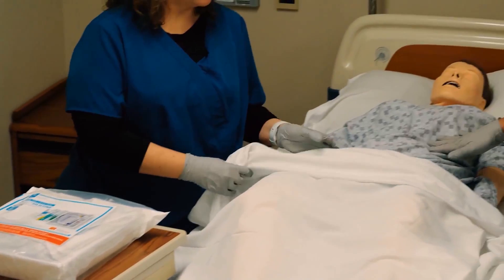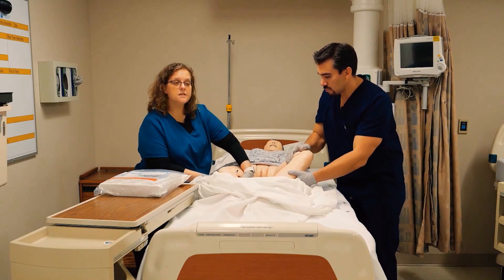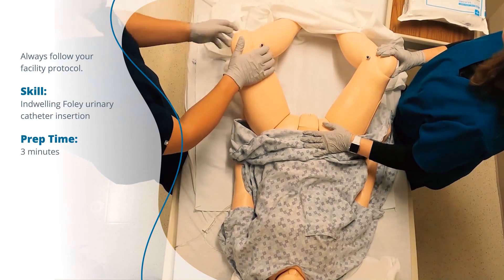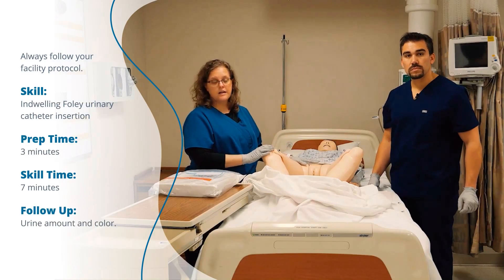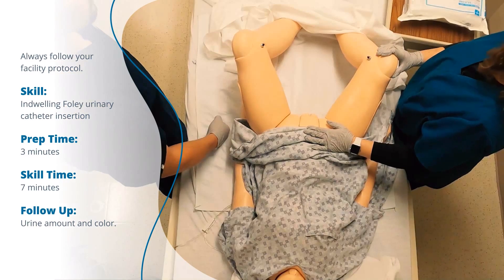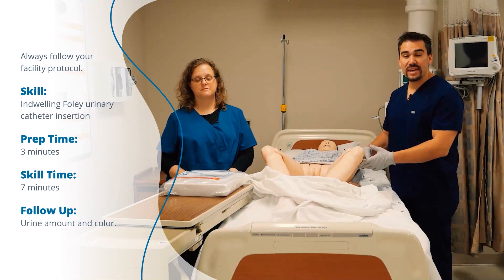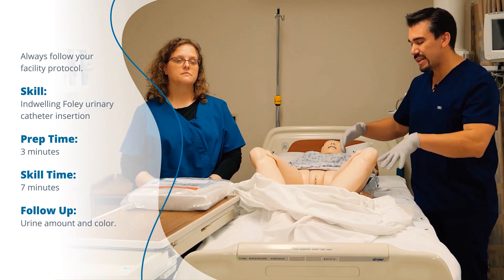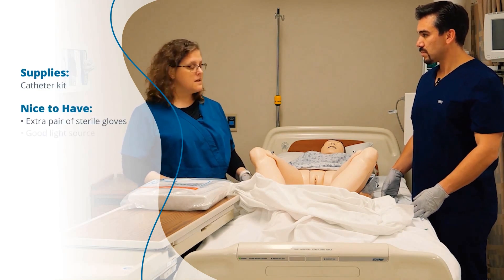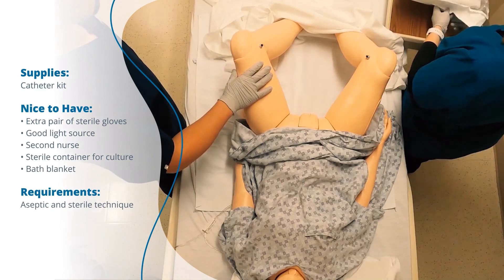Next, we're going to get our patient ready — tell her what's going on, expose only what we need to, and get her legs ready. Many hospitals now require two nurses at bedside to place a catheter because CAUTI rates — catheter-associated urinary tract infections — are so high. One of the biggest things is having the bed raised so you're not leaning over and hurting your back. If you have a difficult placement, you can put something under their buttocks to raise the urethra and meatus for better access.